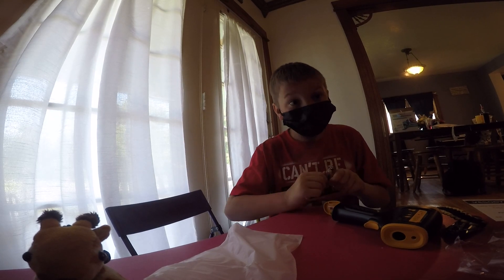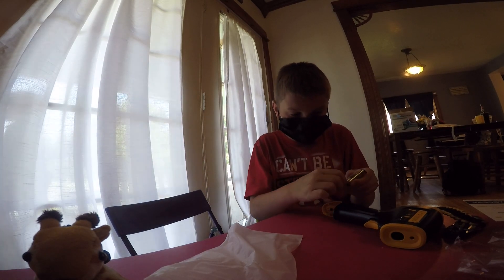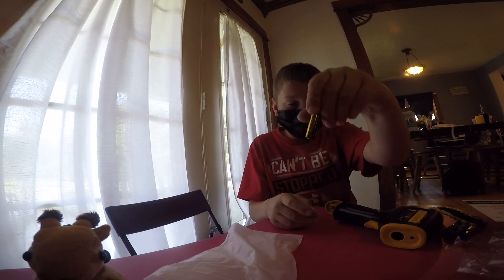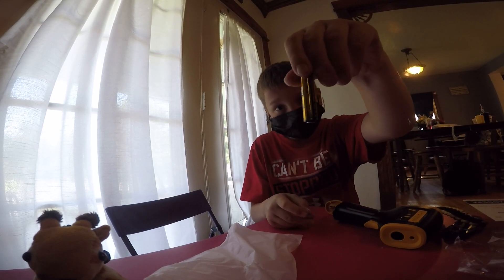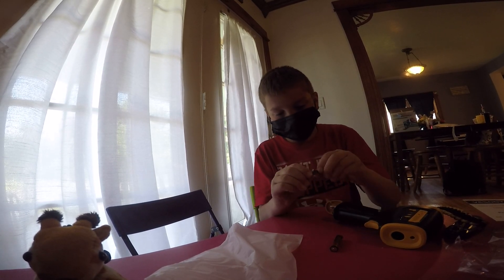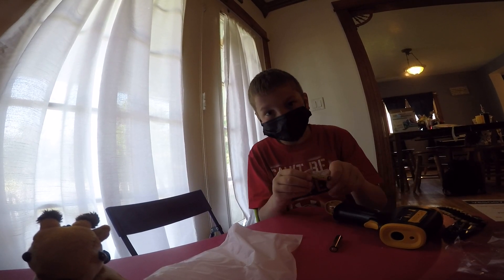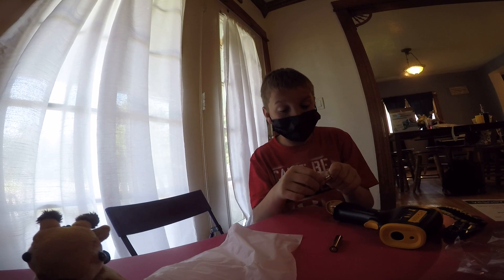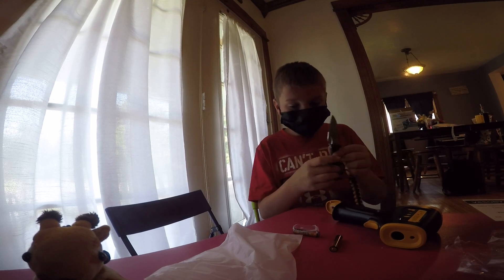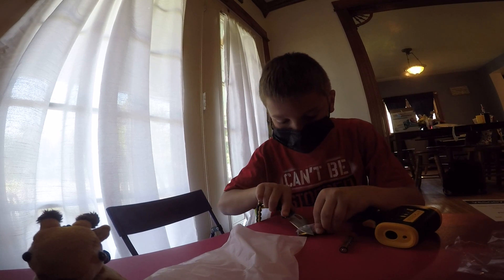They're like tiny batteries. You could probably use Energizer batteries, but they gave us these and you're gonna have to survive with them. Don't drop the battery — yeah, it went straight through.